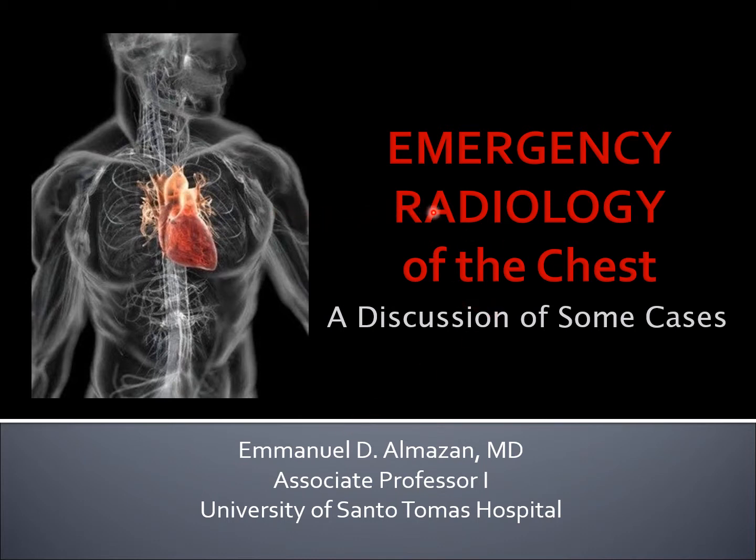Good afternoon, everybody. This afternoon, we are going to lecture on emergency radiology of the chest. This lecture will be quite different from the other lectures as we will be discussing and showing the emergency radiology procedures that are very common in the hospital through case discussion of some cases. Okay?